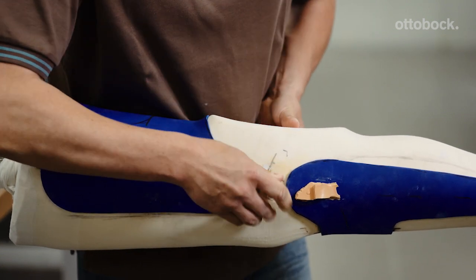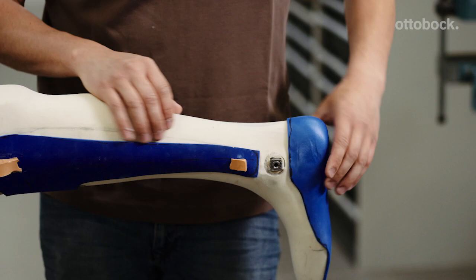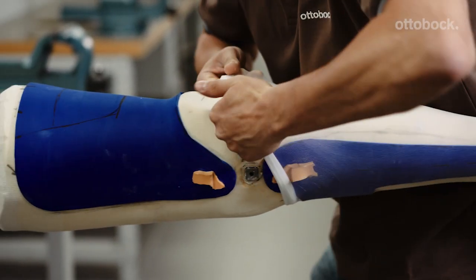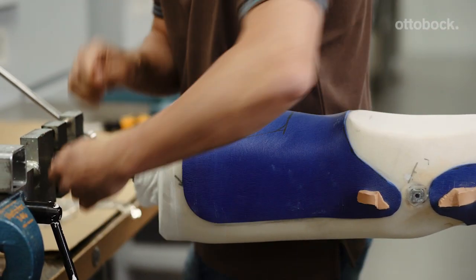Insert the joint alignment adapters and the positioning aid into the adapter sleeve for knee and ankle joints. Pull a nylon stocking over the model and smear the area around the adapter sleeve with contact glue.